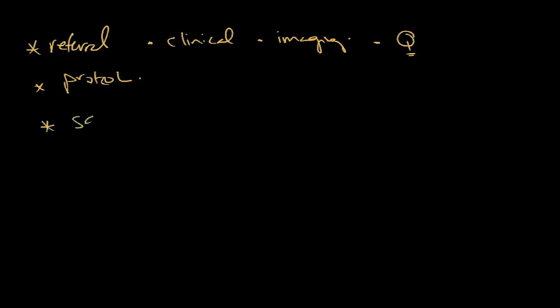Third step will be the safety check. And I can't stress enough how important the safety check is, because we know first do no harm. You need a number of information to go through your safety check. Some centers will send a safety check form to the patient before the scan, so they have all the information before the appointment. Some centers will do this on the day of the scan. Usually, to have this information ahead before the day of the scan is obviously better, because it helps you to plan things in a better way.